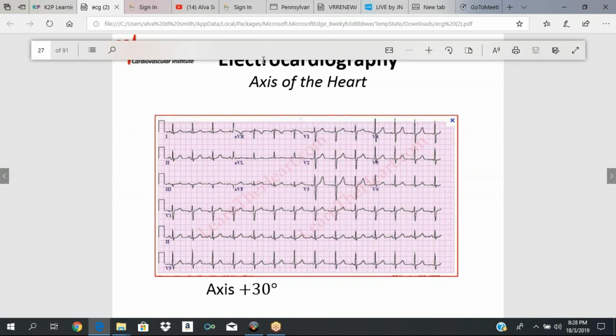That is why you use your cheat sheet for a little bit and then you toss it, because if you use it so many times, then it becomes straightforward. So these are the perpendicular leads. Okay, and they're always going to be perpendicular. So 1 perpendicular to AVF, 3 perpendicular to AVR, and 2 perpendicular to AVL. That's standard. It's not going to change.